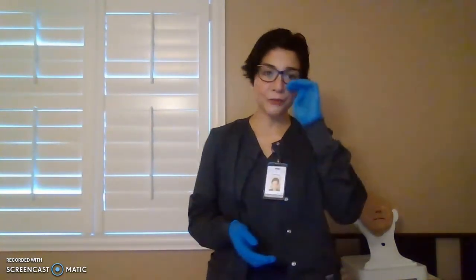Okay, before anything else, I just want to point out some important things to remember that must remain consistent throughout the whole video, and this applies to real life situations as well. First of all, washing technique: exiting and entering the patient's room, donning and doffing of gloves. Make sure you do some good hand washing. All right, next is our patient privacy. Give privacy to your patient for every procedure.